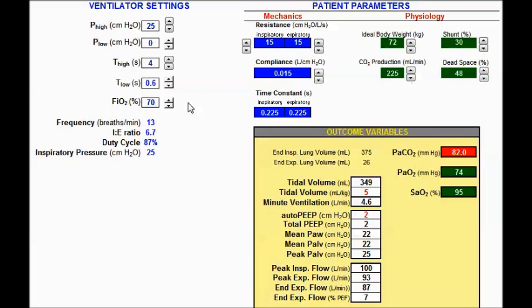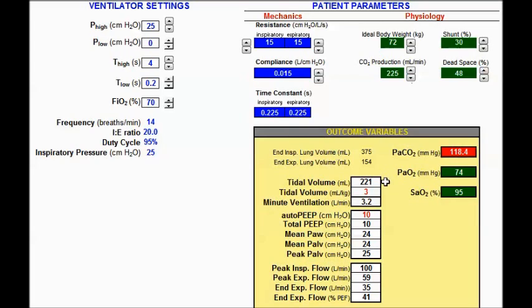A common t-low setting ranges from 0.2 to 0.8 seconds in adult patients — and I am using an adult patient representing myself. Starting at t-low of 0.2 seconds, which is under one expiratory time constant, puts us in approximately that 50 to 75 percent range. Looking at measured values, tidal volumes are in the safe range — smaller than 4 to 6 cc/kg for lung protective strategies — however it is creating quite a bit of auto-PEEP, approximately 10 cmH2O.